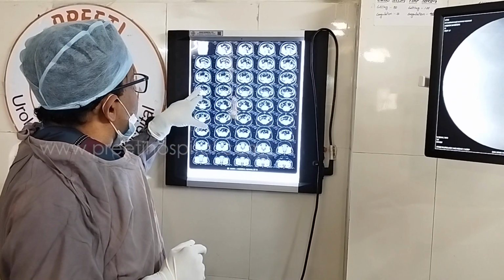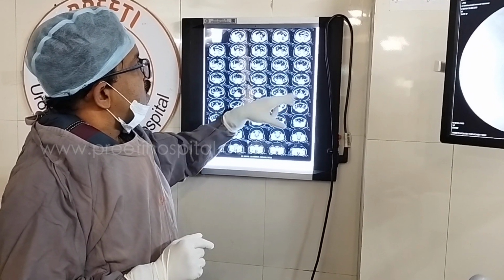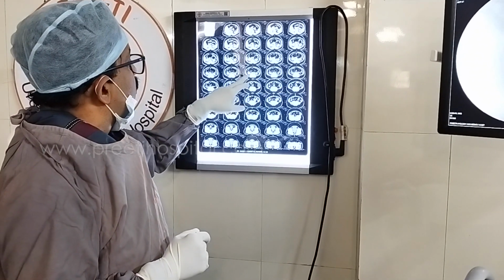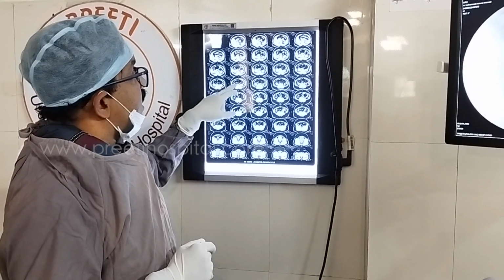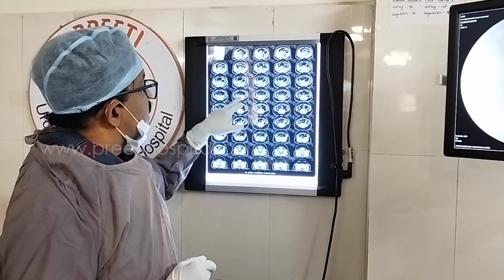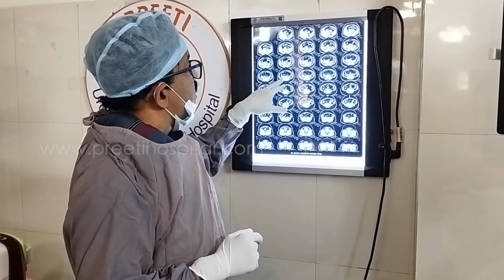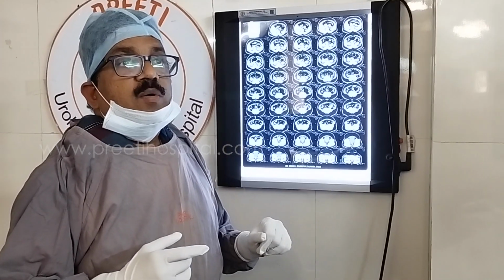After the liver, the colon is anterior, totally anterior. Colon is not at all there. Where is the rib? When you come from below up, wherever the first tip comes, this is the 12th rib. If the kidney is there, come from below, wherever the first structure comes, that is the tip of the 12th rib. You got the point? Where is it? Here. This tip of the 12th rib, if the kidney is there, you can go below and puncture.